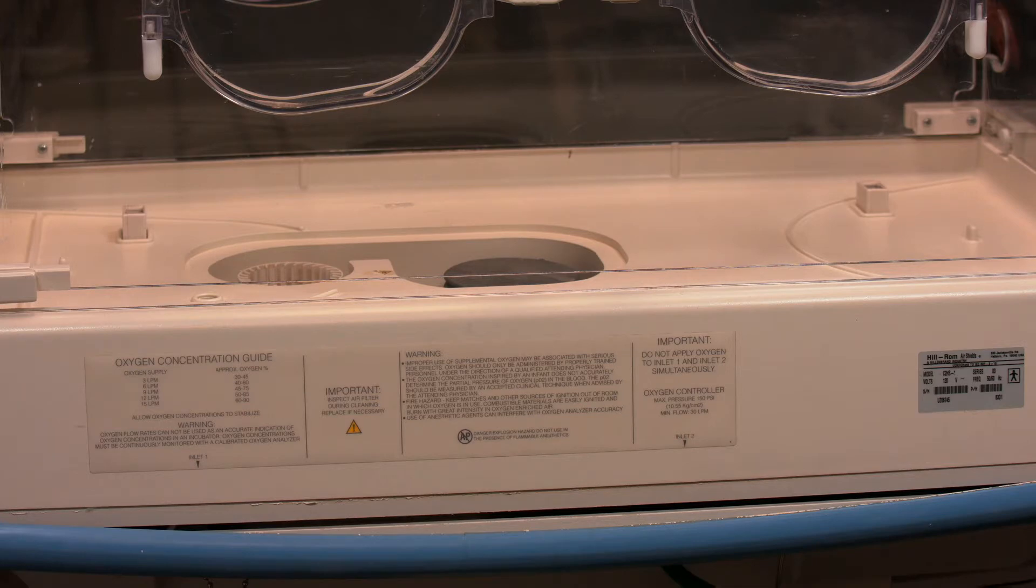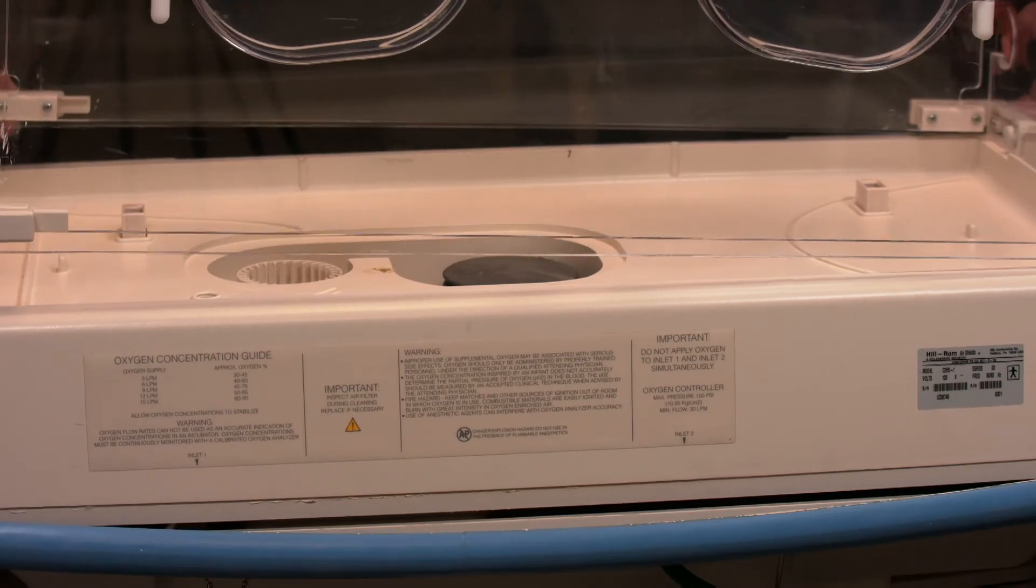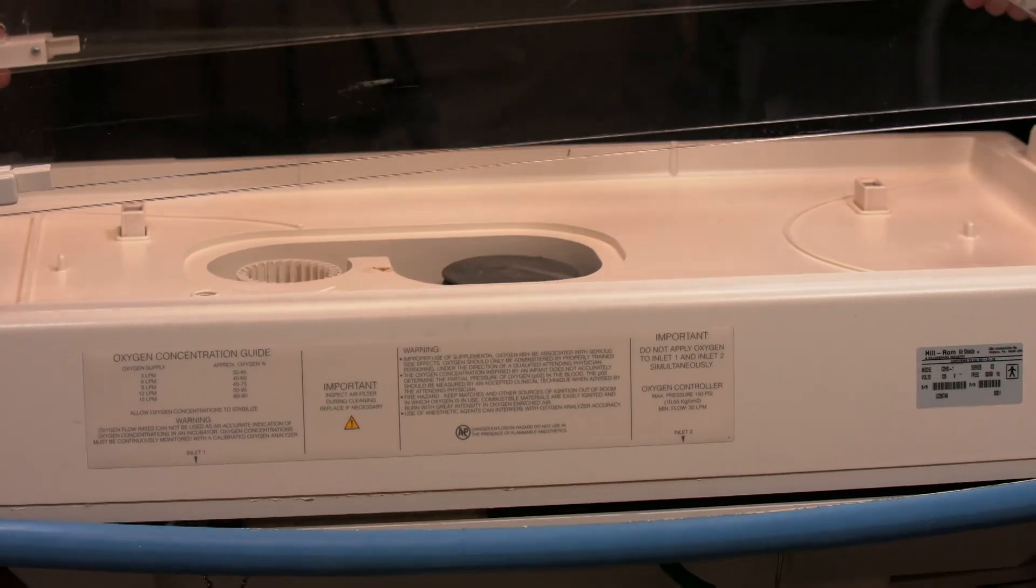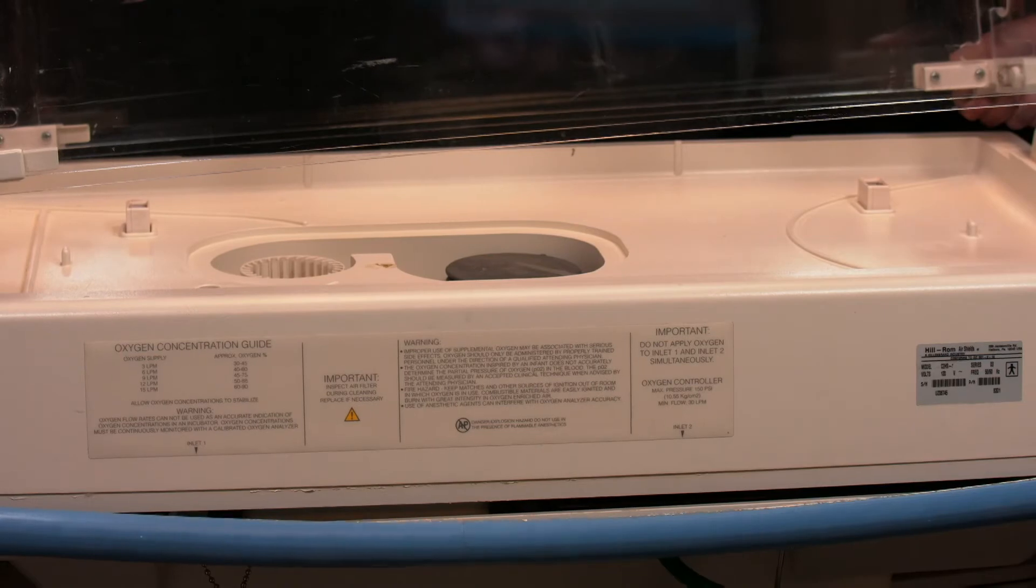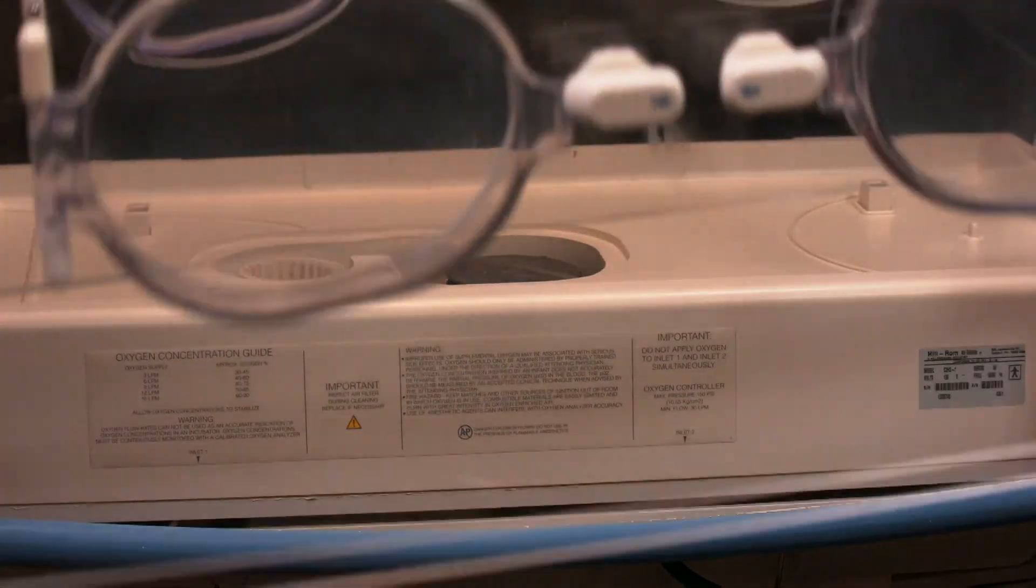The first thing you've got to do to get inside the infant incubator is to take off the incubator casing. The way you do that is you lift it up. There is a latch on one side that you need to unhook. And then you can just lift it off. There we go. And you can just put it away.